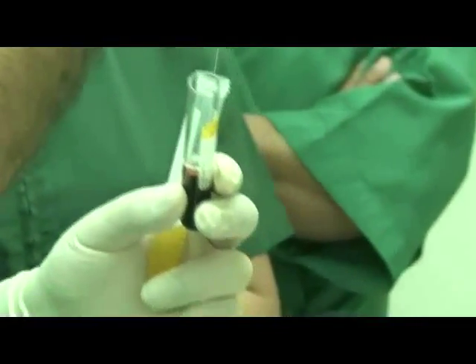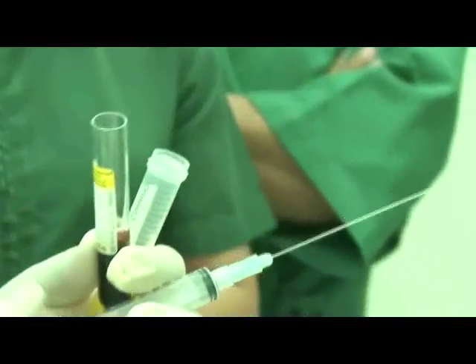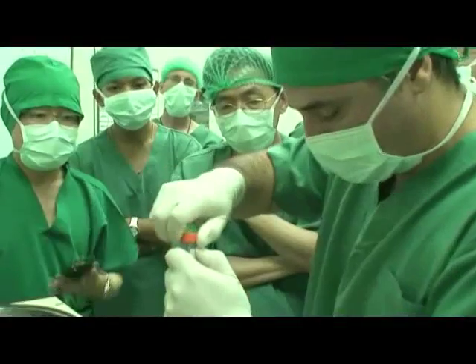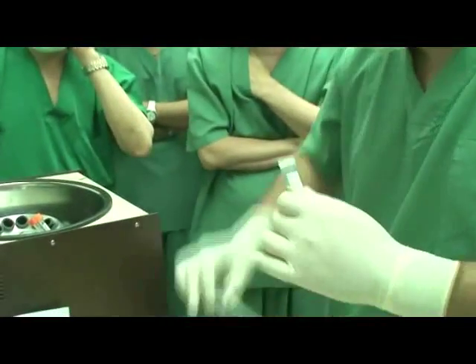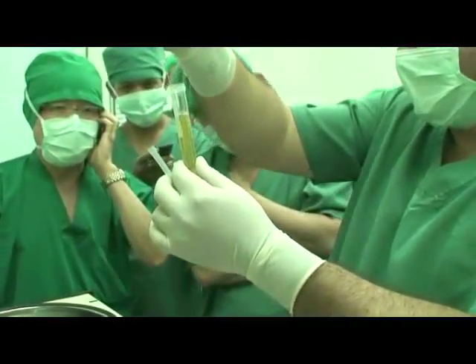Using a spinal needle, draw out the clear PRP liquid at the top of the tube and inject into two new 15 milliliter centrifuge tubes. Place the clear PRP into the centrifuge and spin at high speed.